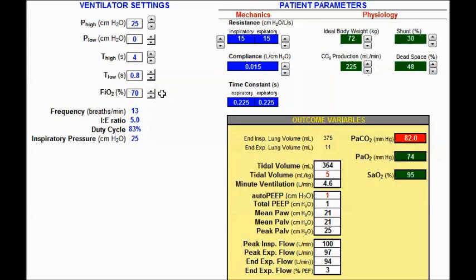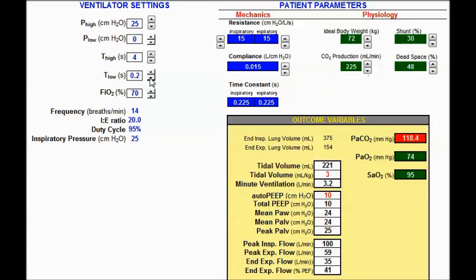Based on these t-low settings in the 0.2 to 0.8 range with compliance at 15, we are ventilating at a safe tidal volume range, though we noticed some auto-PEEP at the lower t-low settings. Now going back down to 0.2, let's say the patient is starting to get better and their compliance changes — I'm going to change the compliance to 30.